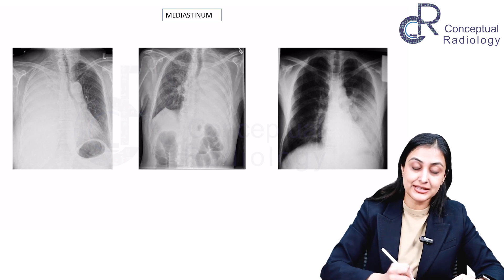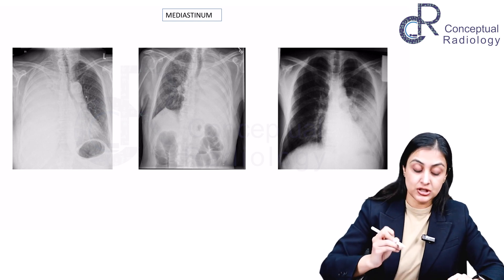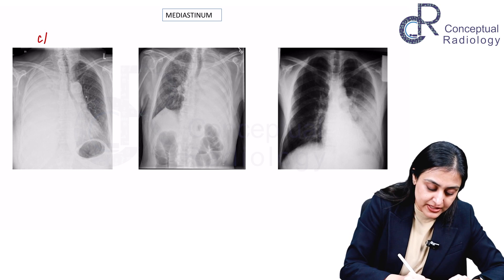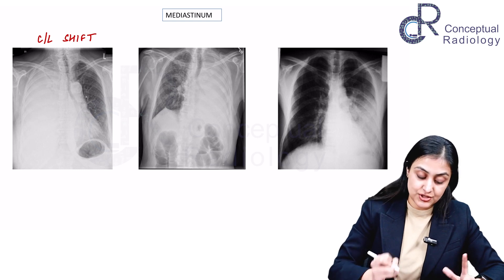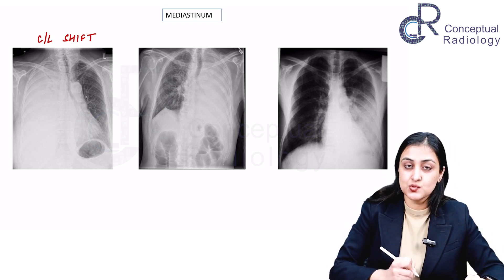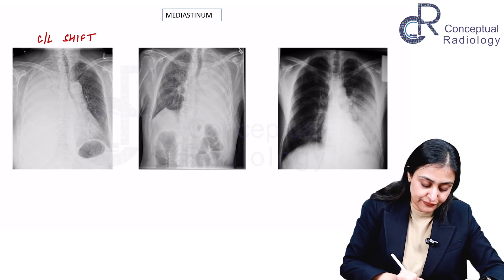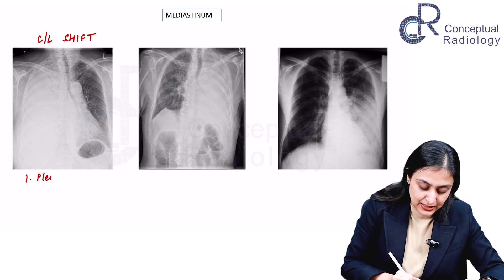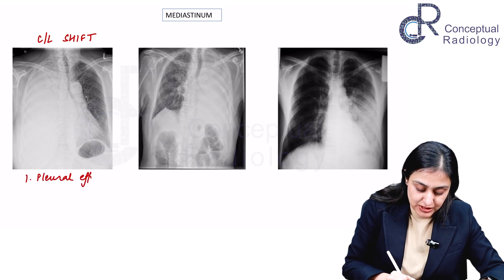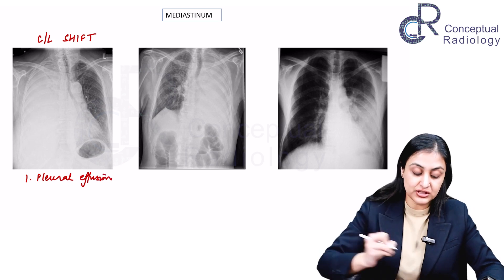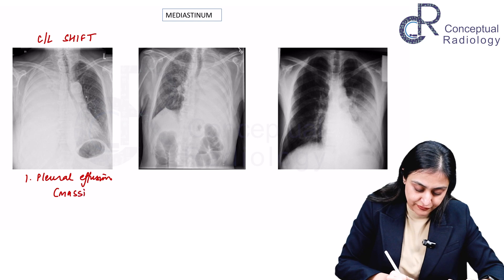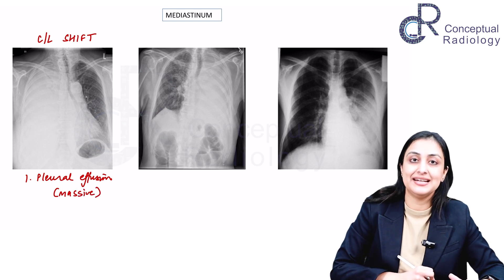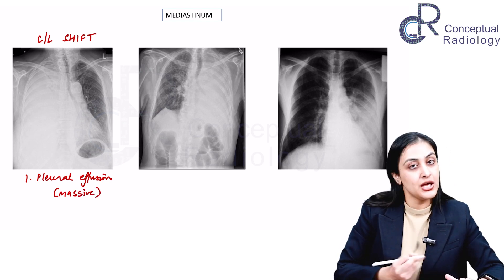Now look at the mediastinum. When we look at the airway, we see there is a contralateral shift — the airway is shifted contralaterally. So the localization is on the right side. In such cases with contralateral shift, your biggest and first differential is going to be a pleural effusion — a massive pleural effusion pushing the mediastinum to the opposite side, since the entire hemithorax is opacified.